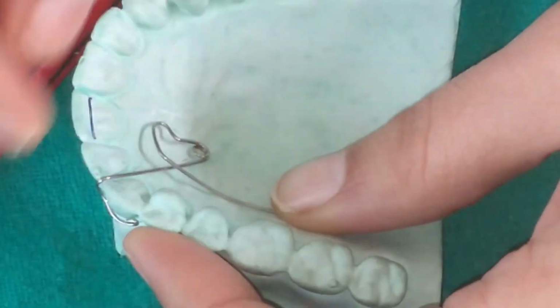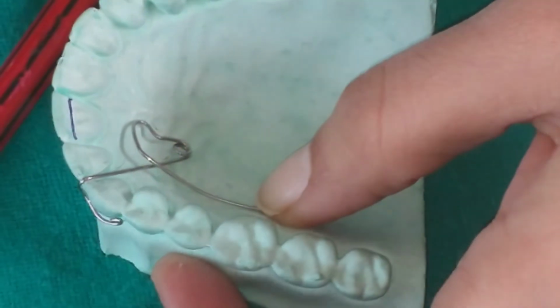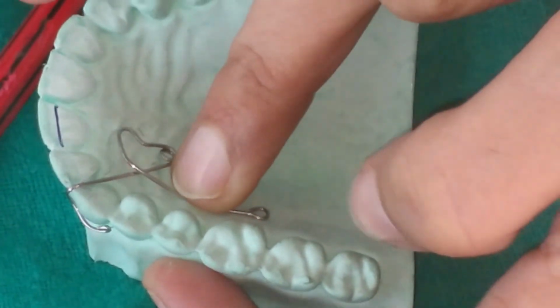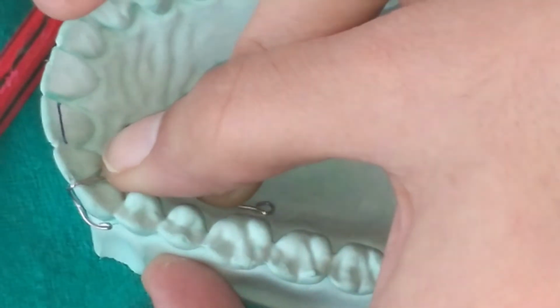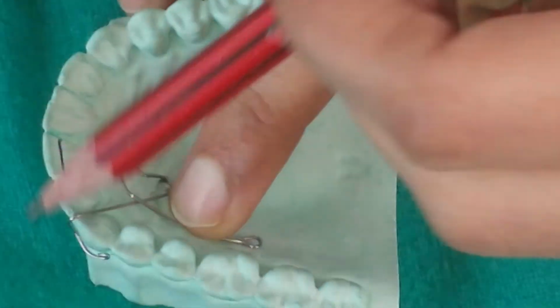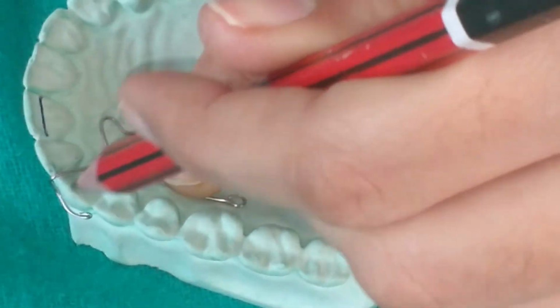The retentive arm should be parallel to the posterior teeth. The retentive tag gets embedded in the acrylic and the active part or the active spring is free. The retentive arm gets embedded in the acrylic and the helix and the active arm are free.